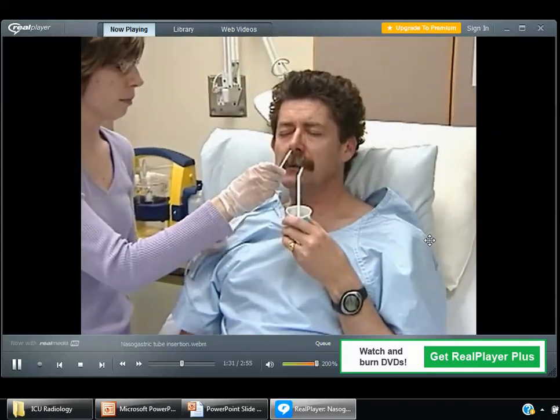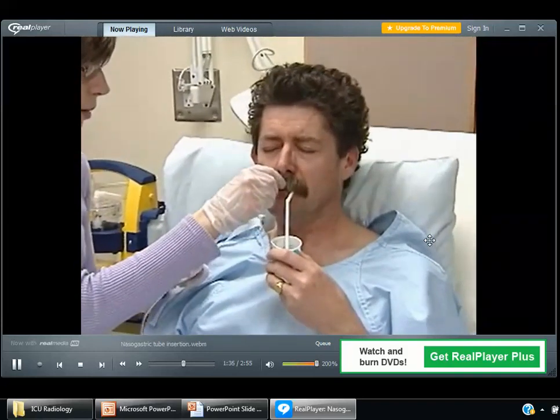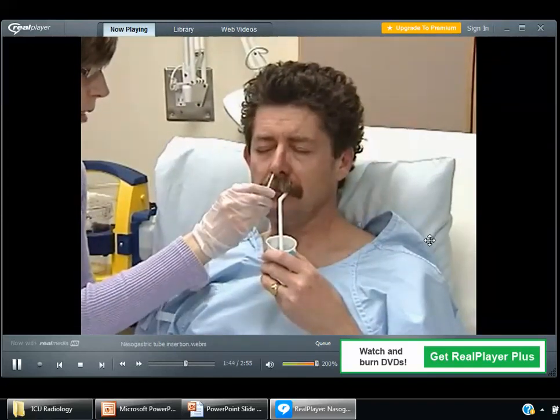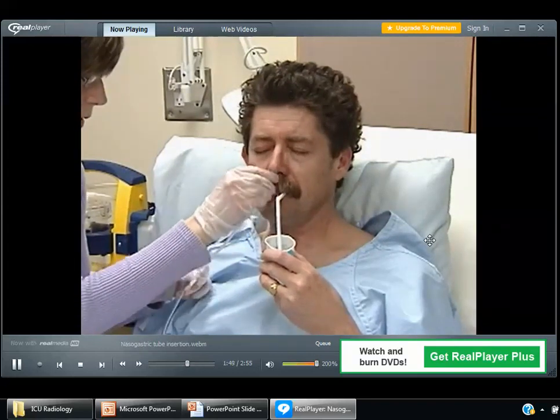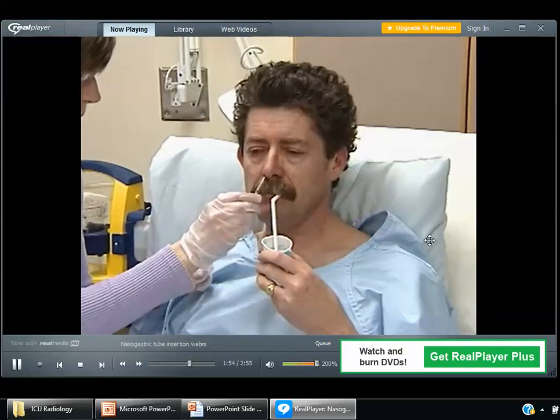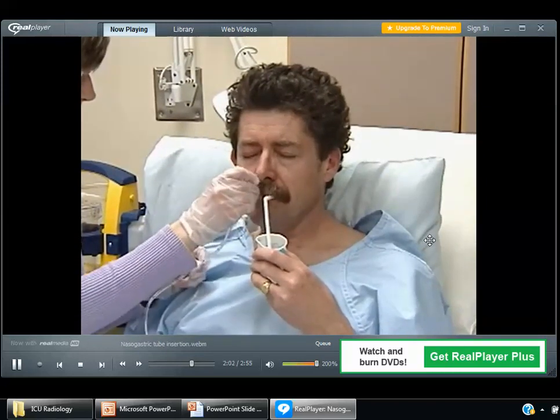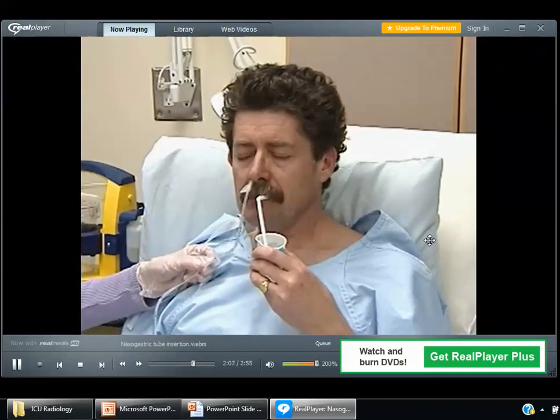With the end of the tube now just above the oropharynx, have the patient flex his head forward, take a small sip, and swallow. You'll advance the tube by an inch or two with each swallow. The patient may cough or gag if the tubing has accidentally entered the larynx. You can pause, withdraw slightly, and ease the patient with a sip of water. Be careful, there is a risk of aspiration. Advance to the measured mark and anchor the tube to the cheek while you make sure the tube is properly positioned. Your patient should be able to speak.